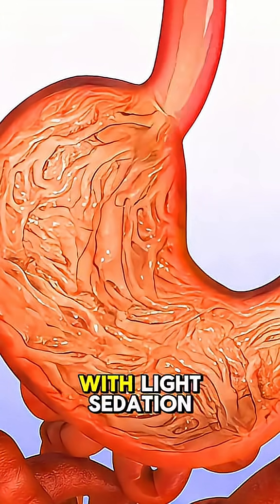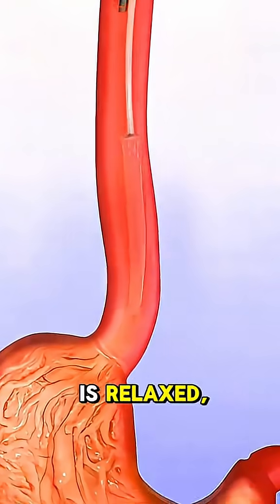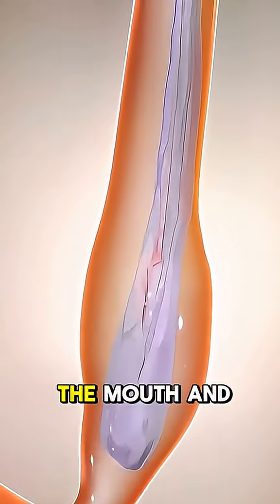The procedure starts with light sedation or local anesthesia for patient comfort. Once the patient is relaxed, a thin, flexible tube called an endoscope is inserted through the mouth and into the stomach.